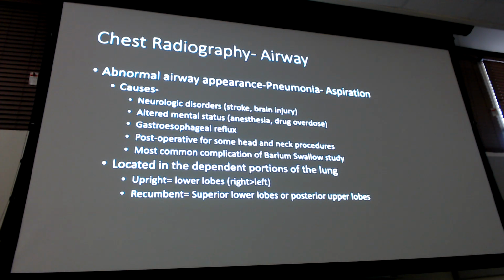GERD goes without saying, reflux comes up, goes back down. Post-op for head and neck procedures, and the most common complication of the barium swallow study, again, things we're drinking go down into the airway.